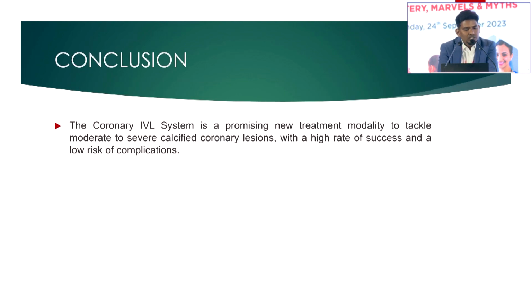So my conclusion: the coronary IVL system is a promising new treatment modality to tackle moderate to severe calcified coronary lesions with a high rate of success and a low risk of complications. Thank you.